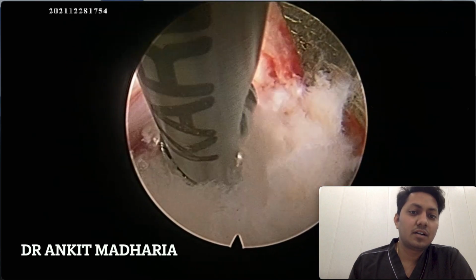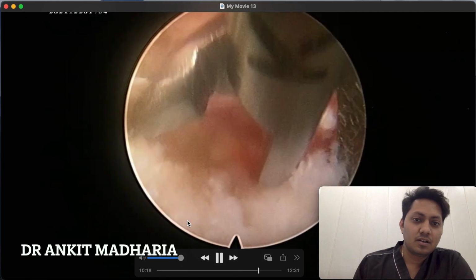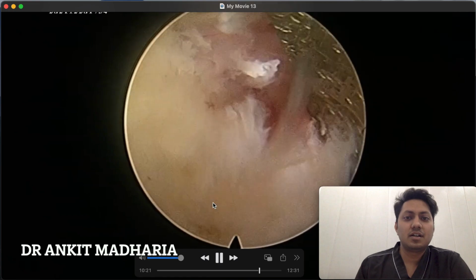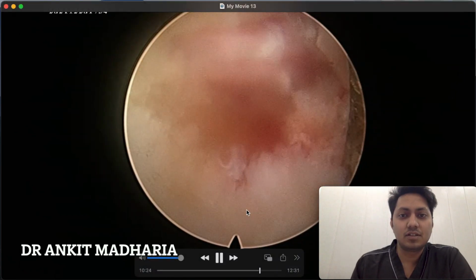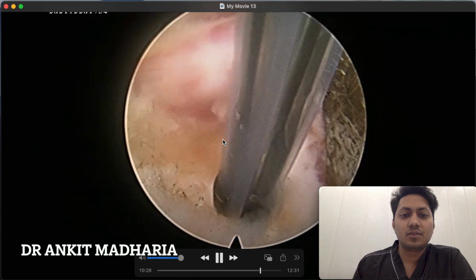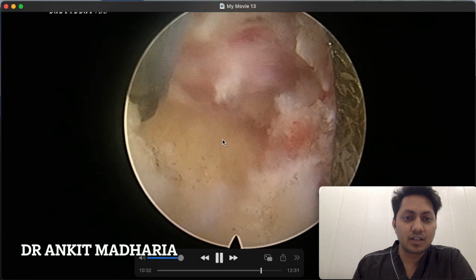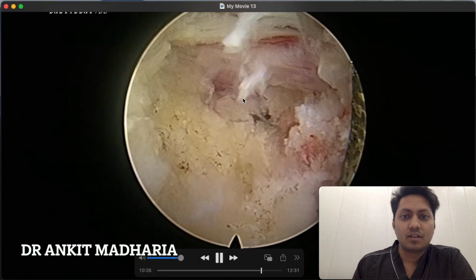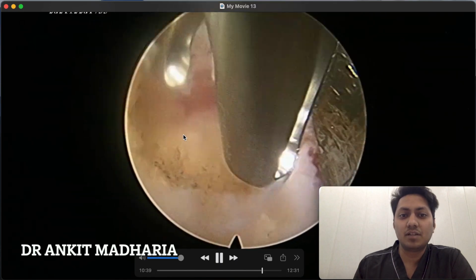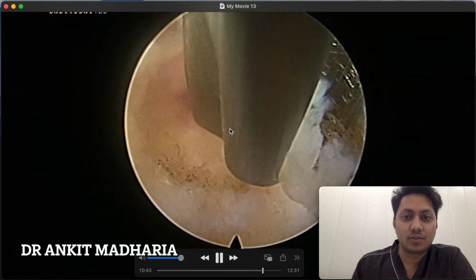As you can see, this surgery does not take much time. The whole procedure has been done in about 20-25 minutes, and you can see it's just a 12 minute video of the whole procedure. So the stenosis surgery by transforaminal route is not very difficult, but knowing the target is quite important. You can see our traversing root is now very well decompressed in the middle zone, and just some remnants of the disc have been removed right now.